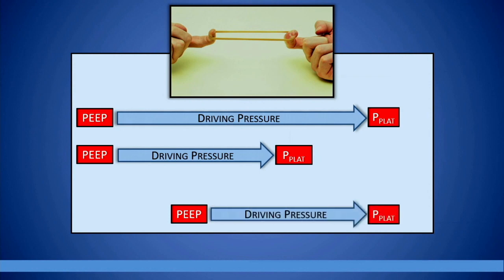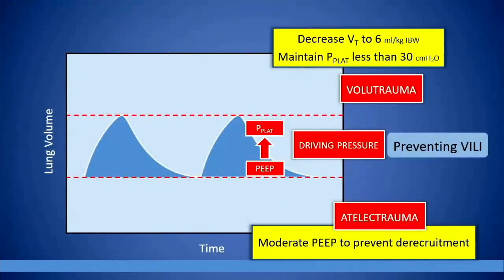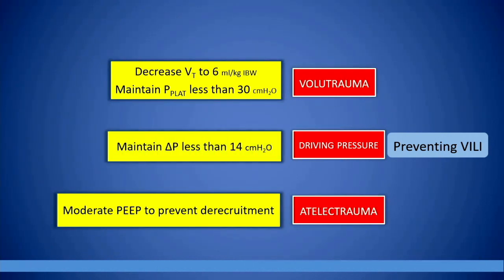If you increase the PEEP, your starting point from where you start the stretch, you can also decrease the driving pressure. That is provided that you actually open the lung with that increase in PEEP, all right? You have to make the space bigger. You have to make the baby lung bigger in order to put the same volume in and create a lower driving pressure. So that is kind of a qualified answer, but perhaps one of the best answers you come up with. So you go back and you say, all right, I will protect the lung from too much volume and too much pressure. I'll put on a moderate level of PEEP, and I will now pay attention to what I'm doing in between, which is called the driving pressure, and try to maintain that less than 14.